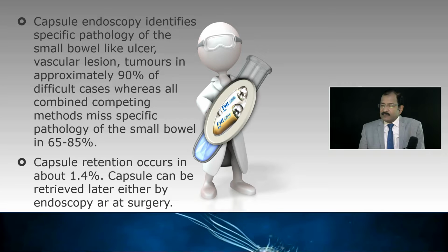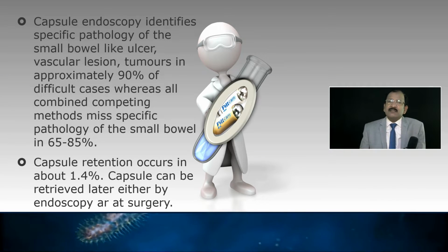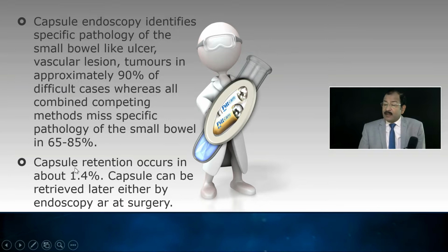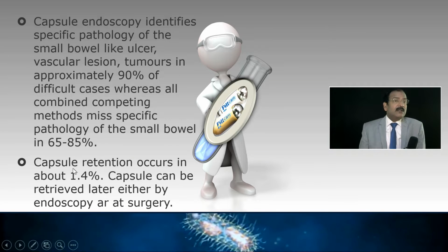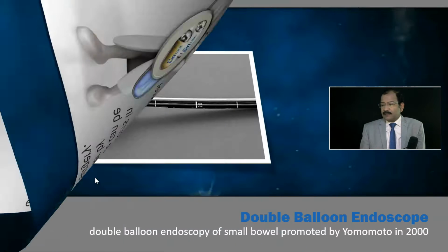So this is basically only used in patients where conventional endoscopy is contraindicated. Another problem is that capsule retention can also occur. In 1.4% of the cases, capsule retention occurs.